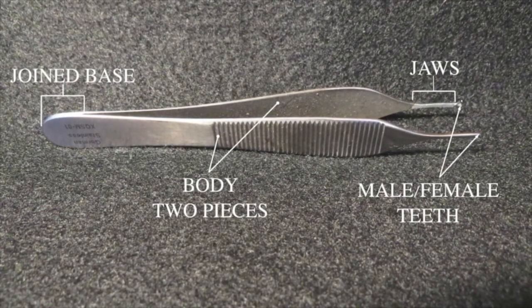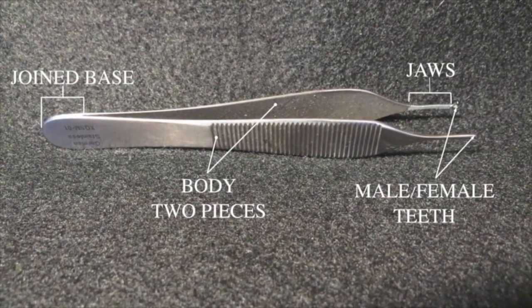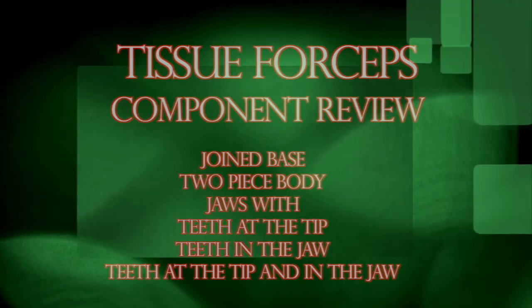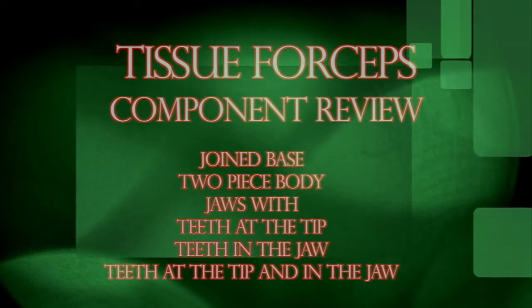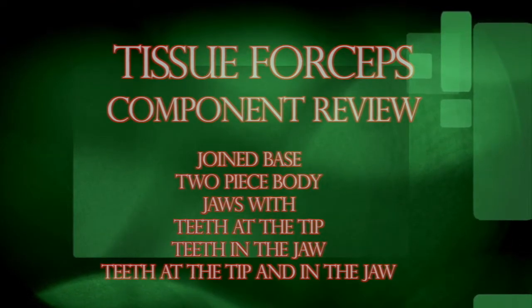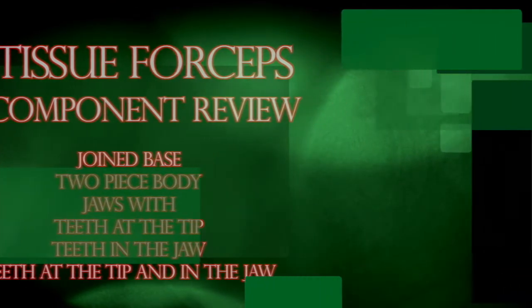Please pause this program to become familiar with these component parts. Tissue forceps component review: tissue forceps have a joined base, two body pieces, jaws with teeth at the tip, teeth in the jaws, and teeth in both the tip and the jaws.